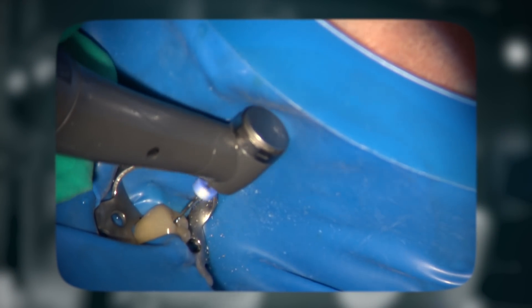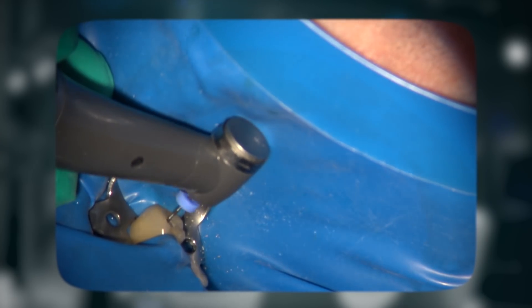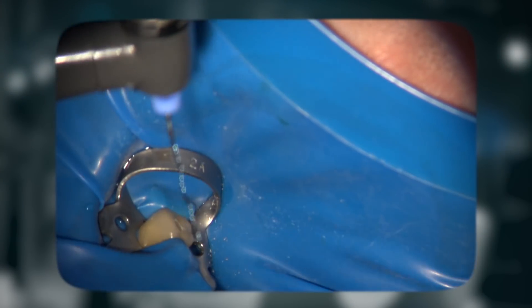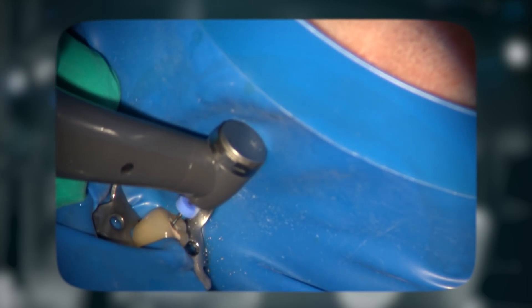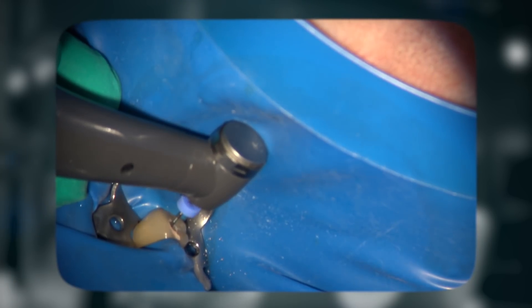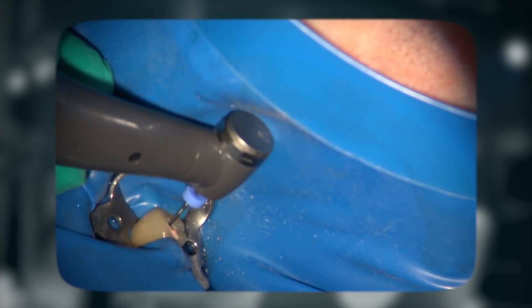the 3D shaper file was used at 1000 RPM and 200 gram-centimeters of torque in an up and down motion while on the EndoSync handpiece, and the EndoSync was connected to the EndoSync AI apex locator. This is a very nice combination because the connection of the EndoSync AI to the EndoSync allows you to know where you are in the root canal during the retreatment process. As you get closer to the apex, the EndoSync AI will indicate and signal that you are at the apex, and if you have programmed the handpiece to stop at the apex, the instrument will actually stop.